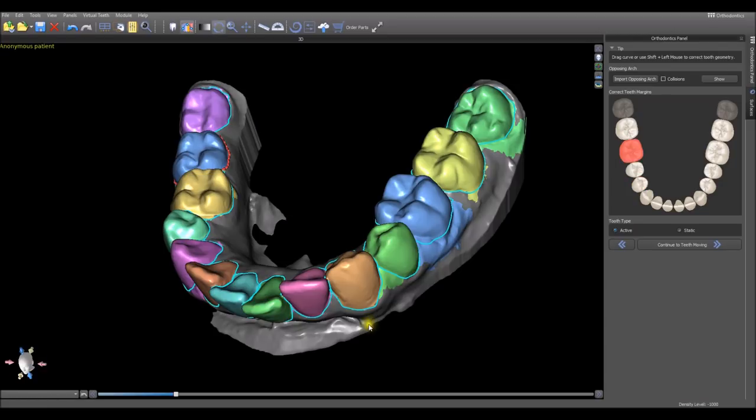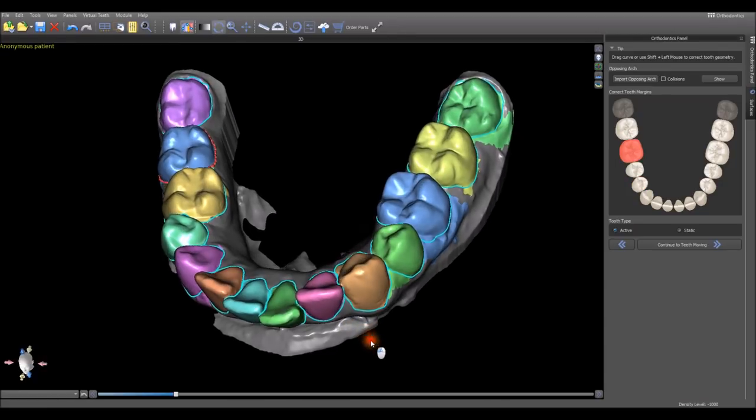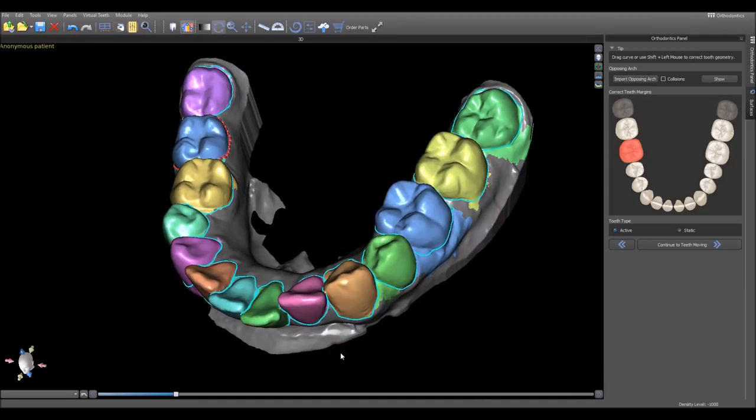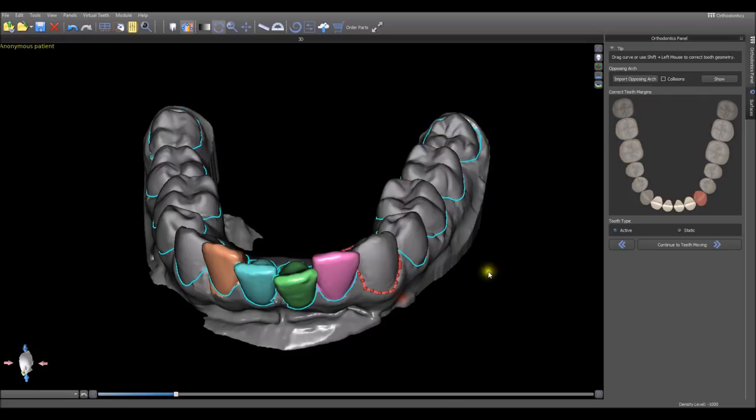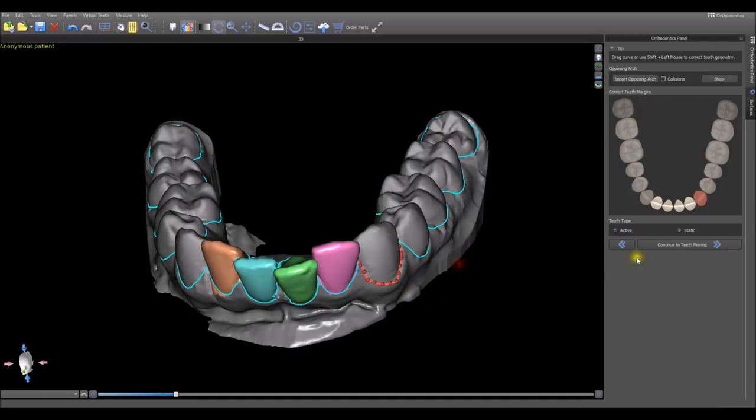If there are teeth that we're not going to be moving, that we want to stay static, we can right click on the tooth and you can see how the tooth becomes deactivated.